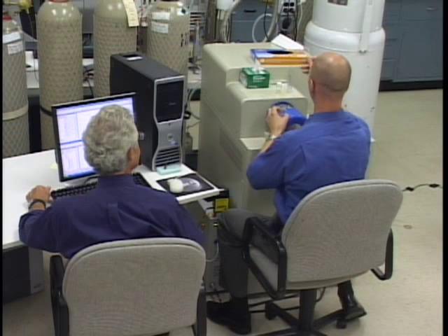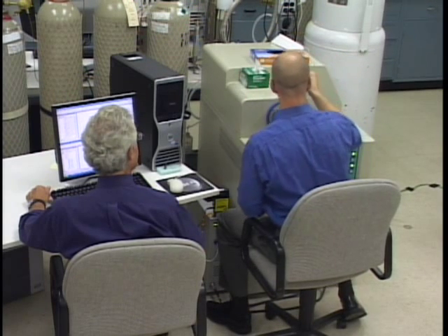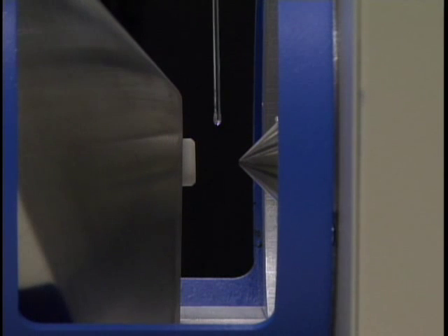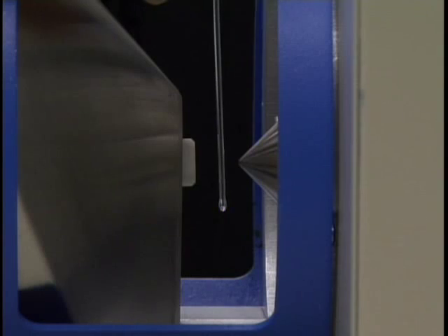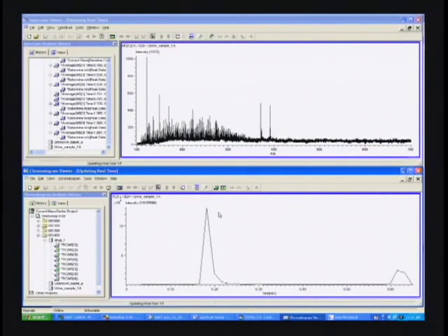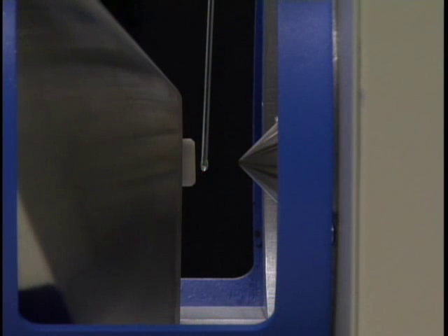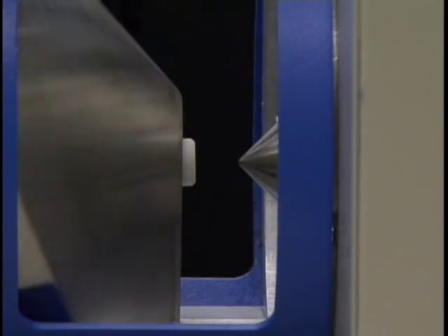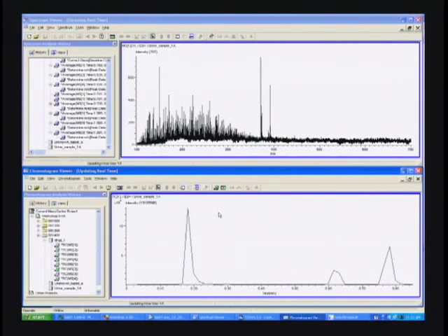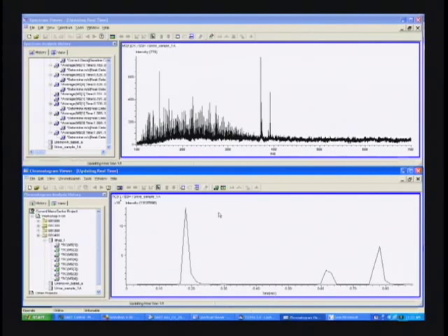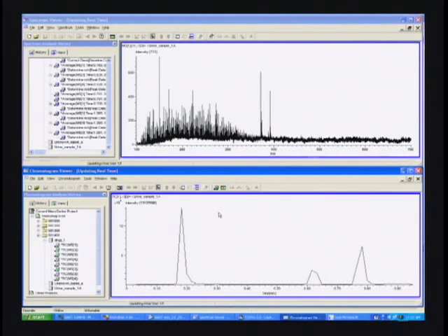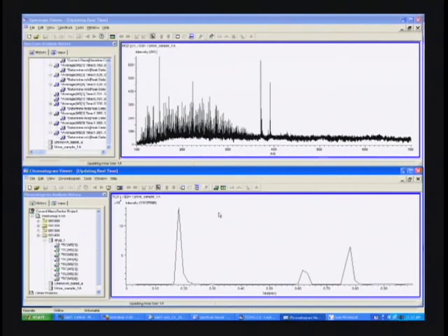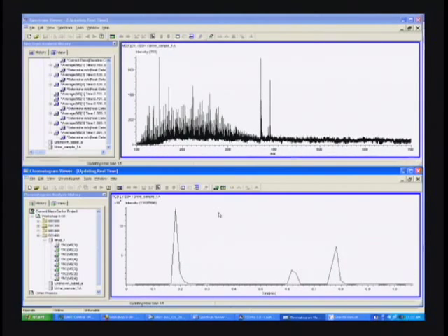Glass melting point tube, I'm just going to dip it into the sample so we've got a little urine that hangs on it. Then drop it down into the stream. Got some peaks there. Run it through again, just so we've got another. While it's still running on the same data set, we'll just put the other sample in here.